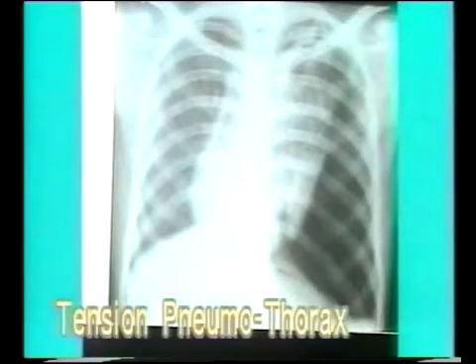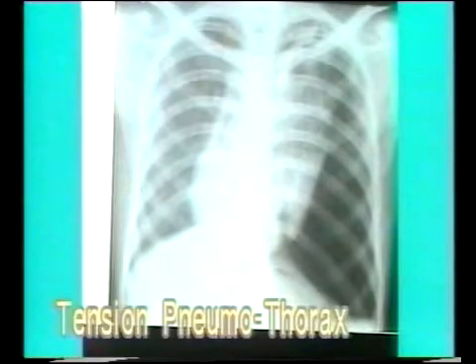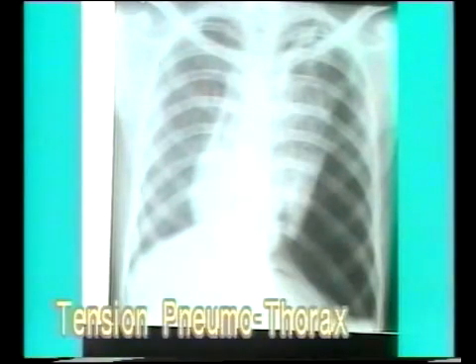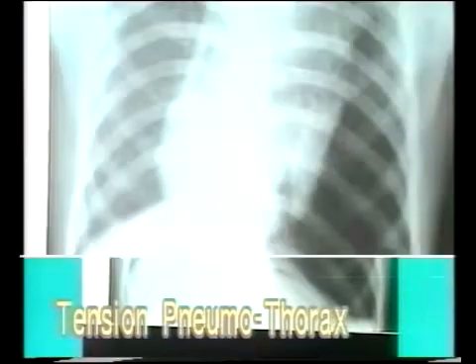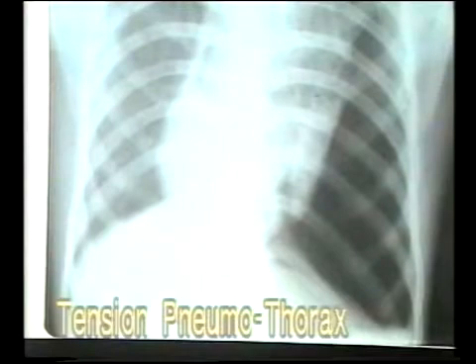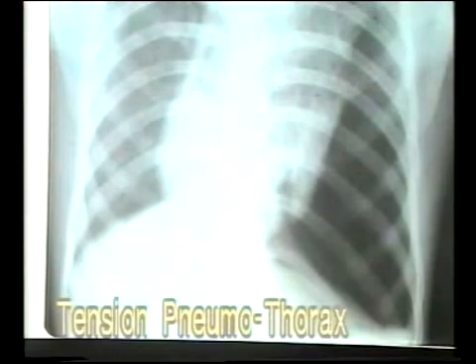This is one more X-ray of tension pneumothorax. Note the radiolucency over the entire left hemithorax, complete collapse of the left lung and signs of high pressure in the left pleural sac — that is, the mediastinum is shifted to the opposite side compressing the opposite lung. The diaphragm is pushed downwards and flattened and the intercostal spaces are wider. This is tension pneumothorax.